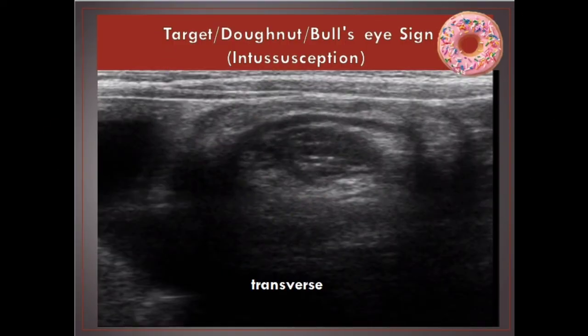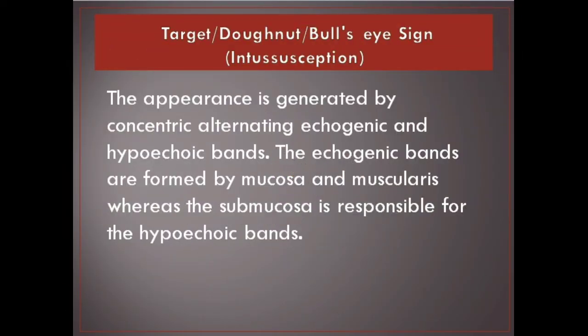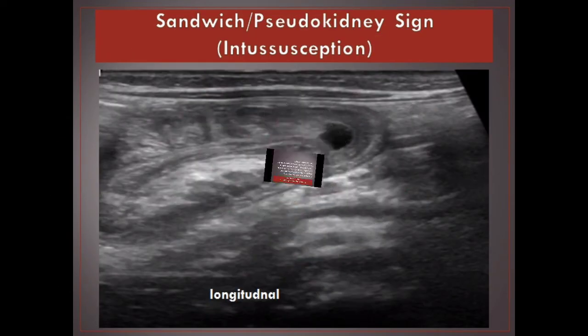Target / Donut / Bullseye sign. The appearance is generated by concentric alternating echogenic and hypoechoic bands. The echogenic bands are formed by mucosa and muscularis, whereas the submucosa is responsible for the hypoechoic bands.